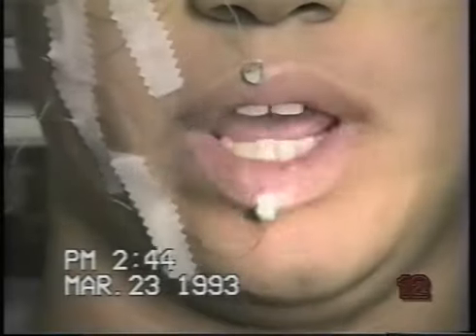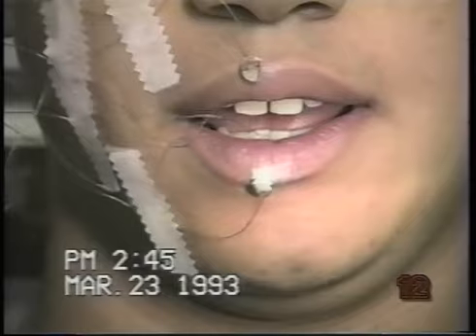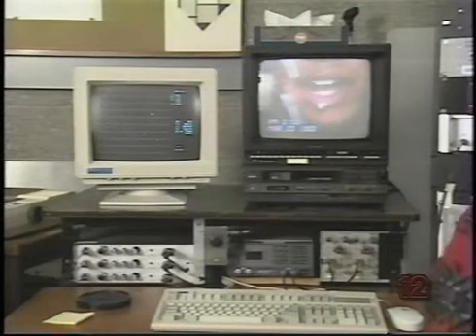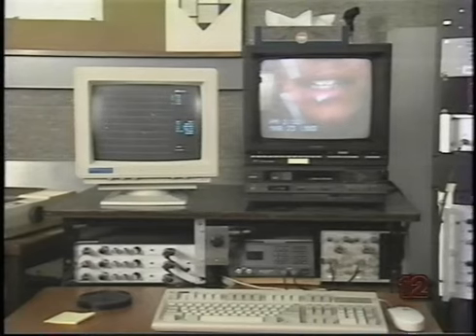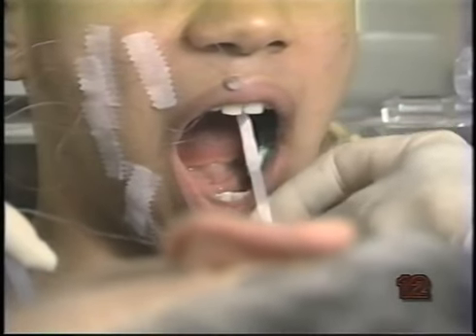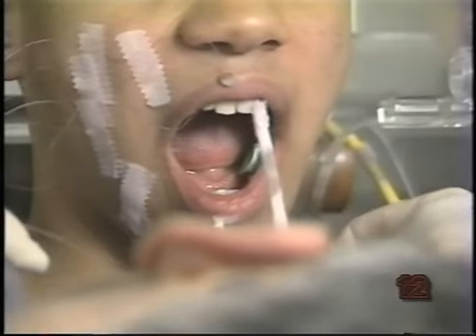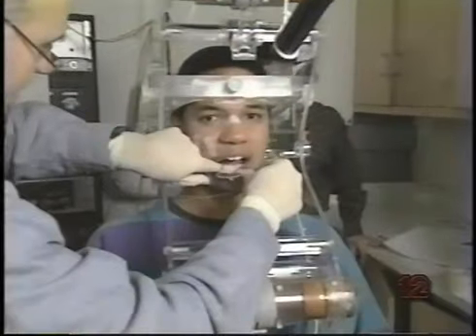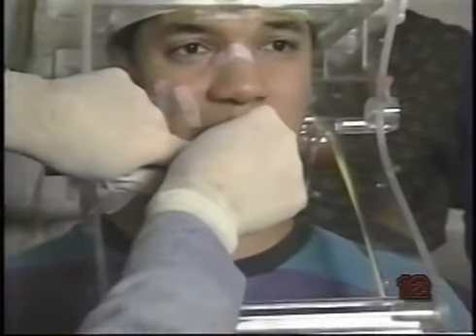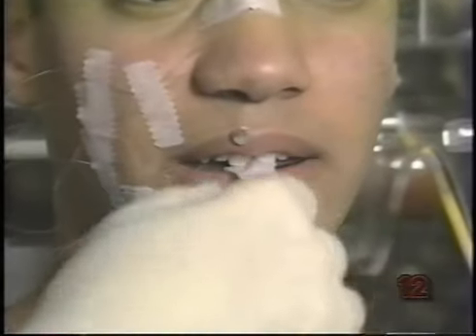We also make a video recording of the subject's lips. This recording is synchronized with the EMMA recording, so we can relate EMMA data on lip positions to labial cross-sectional areas. When the speech data have been collected, we record the shape of the subject's palate by drawing a transducer along its midline. In addition, we record the orientation of the occlusal plane by having the subject bite lightly on a plate that has 2 transducers mounted on it.